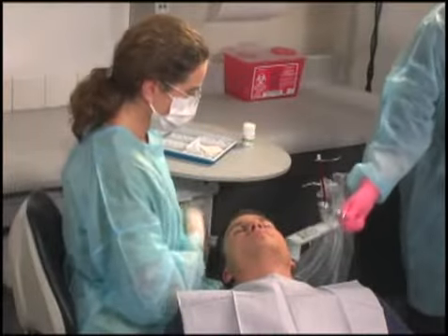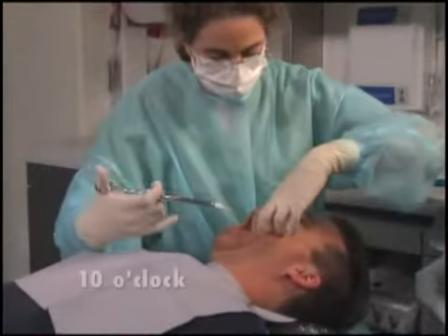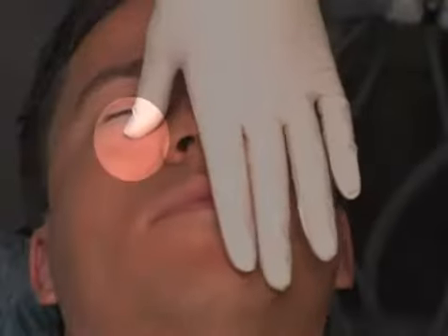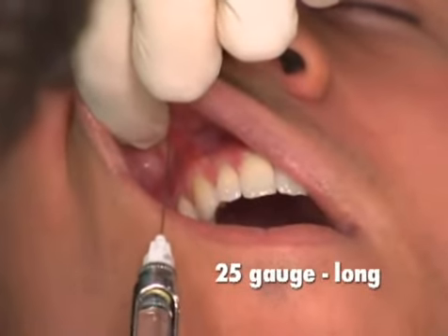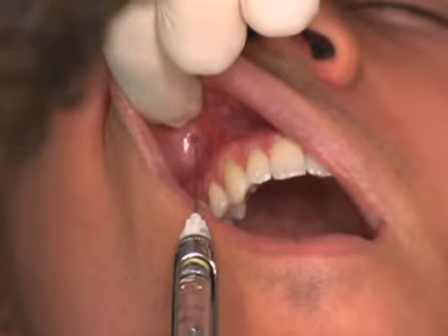For a right or left ASA nerve block, the right-handed operator should sit at the 10 o'clock position facing in the same direction as the patient. The infraorbital foramen is palpated and the lip is retracted. A 25 gauge long needle is inserted into the height of the buccal fold adjacent to the maxillary first premolar.